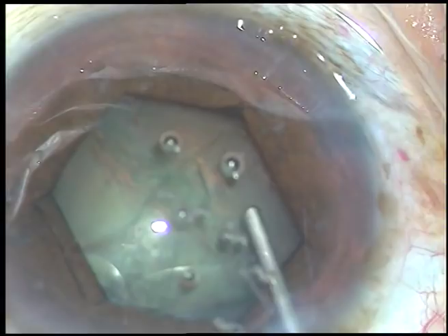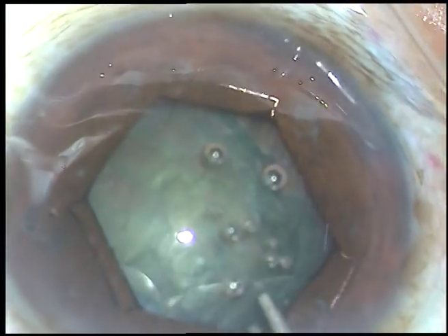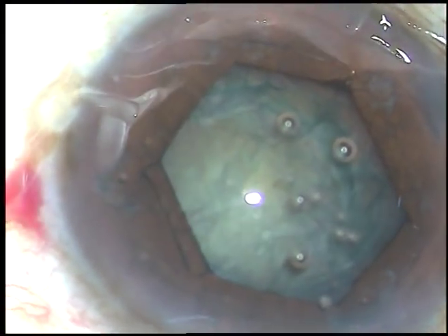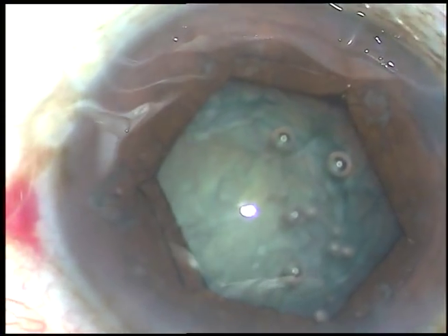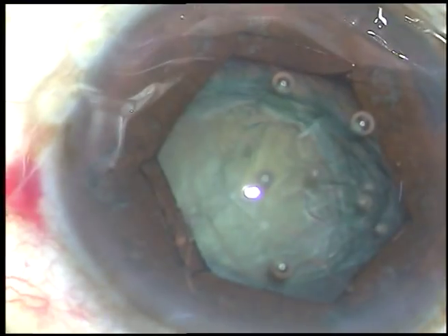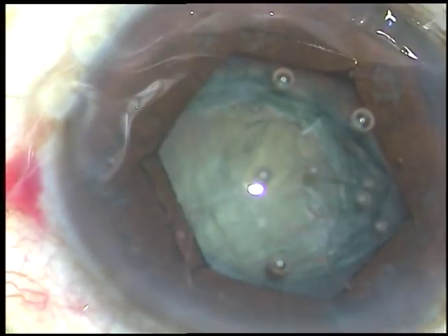Hydrodissection is done. We must be very careful during hydrodissection because the pupil is small — there should not be a blowout rupture of the posterior capsule. We should not inject a lot of fluid underneath the anterior capsular rim.